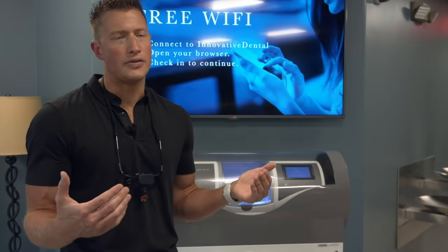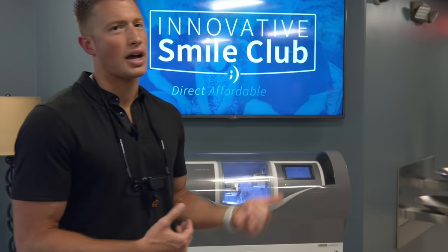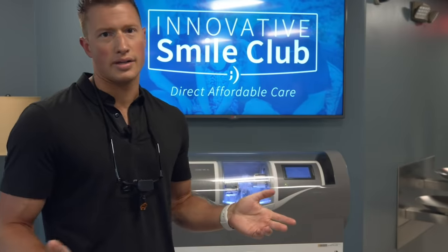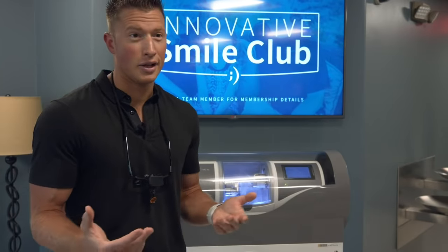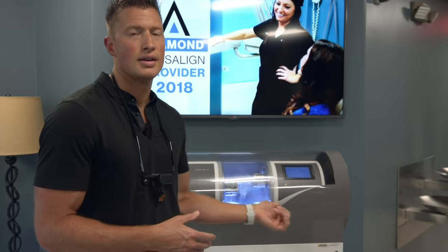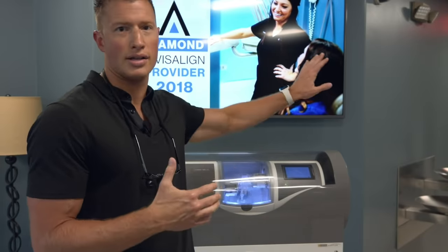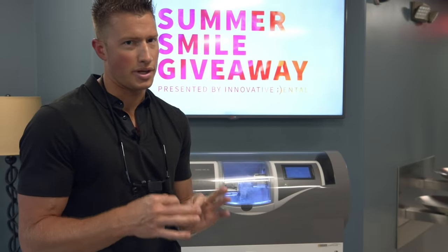So, the need for sedation, that's going to be a question I'm shocked no one's asked yet. Trey's not going to be sedated. He's going to be under local anesthetic. He's not going to feel a thing, and we're going to be done in 10 minutes. So the implant will be placed precisely where we want it to go because we're using this. And I don't need to make that incision because the bone has already been visualized with our 3D x-ray, and we're using the guide to make certain we place it in the right spot.